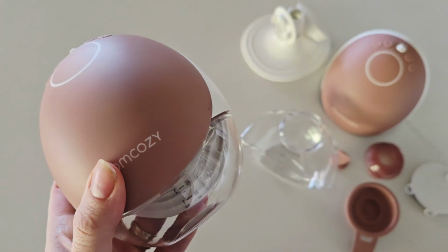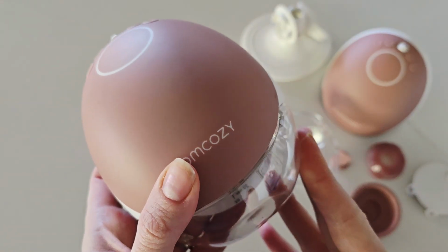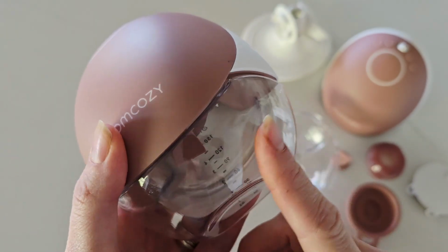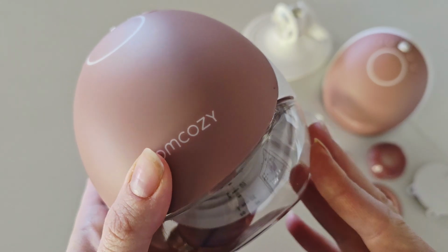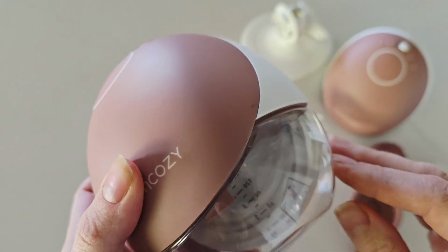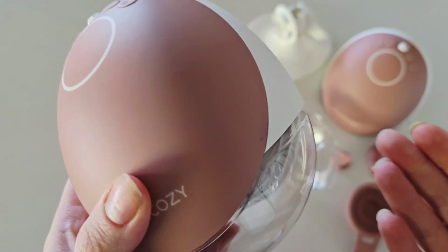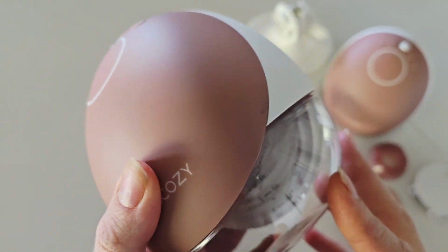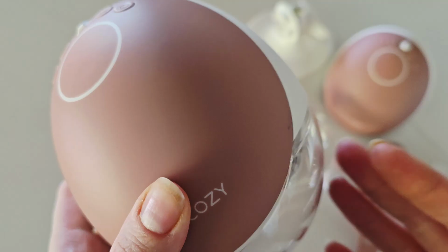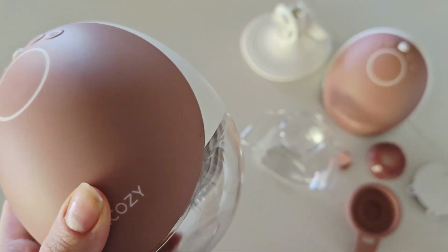You might notice just over time, just general wear and tear. So you might find a few scratches if you've accidentally dropped your pump. You might find some of your harder plastics get discolored from using a sterilizer. They might even warp if you've used too high of a heat during sterilization. This all can potentially lead to areas which can harbor bacteria, which then can be harmful for your baby. So especially scratches, we want to make sure that our pumps don't have any damage to them.